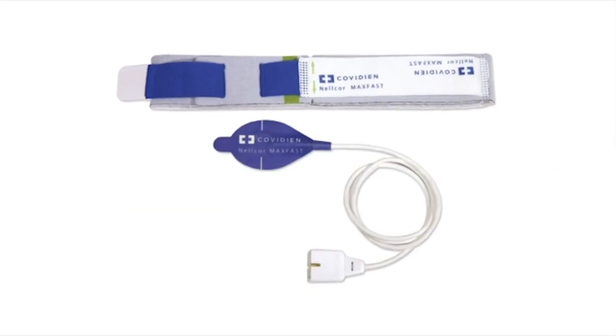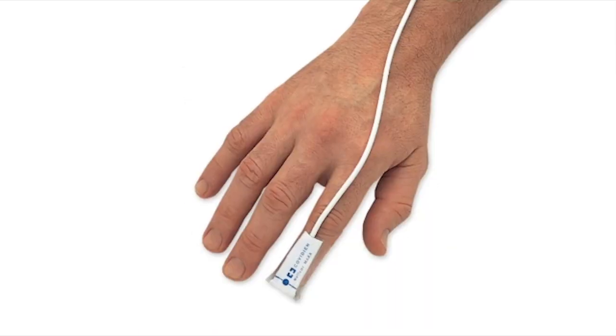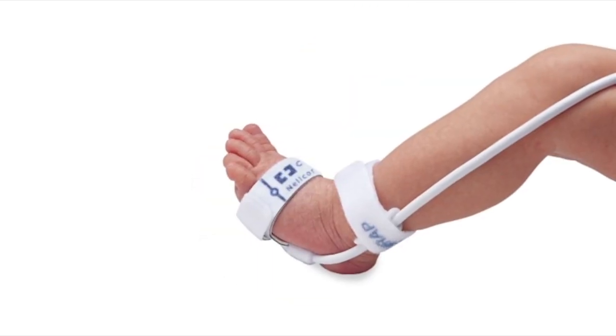The monitor provides connectivity to analytic tools and patient management systems. It is compatible with the entire line of Nellcor sensors with OxyMax technology and with Nellcor specialty sensors.